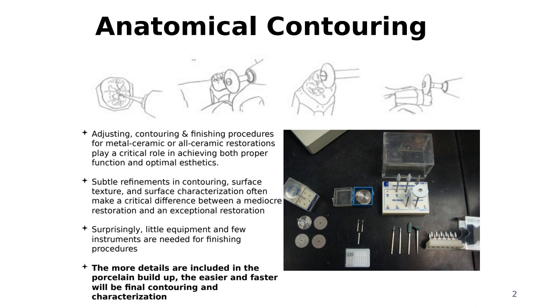What happens if a patient has a big diastema? And if we close that diastema, then the teeth are wide. They're really big teeth, right? So what type of materials can we use, and how can we shape and design those contours of the crowns to make them look narrow, but also be functional, because that's what we want.